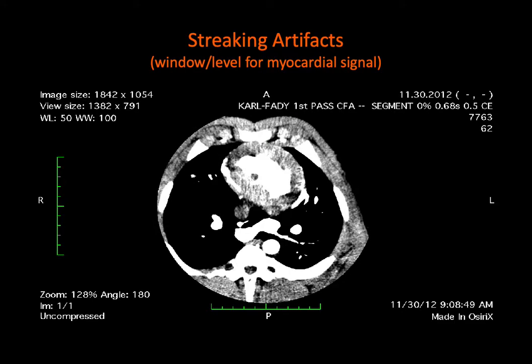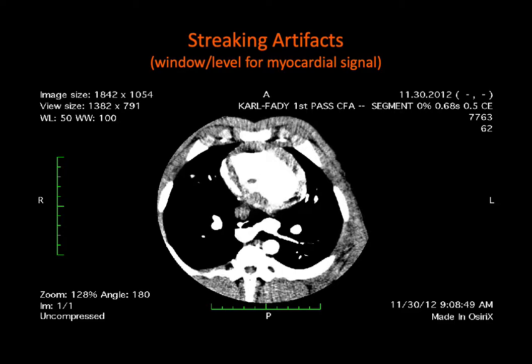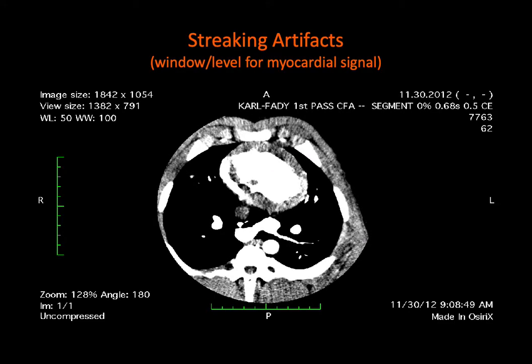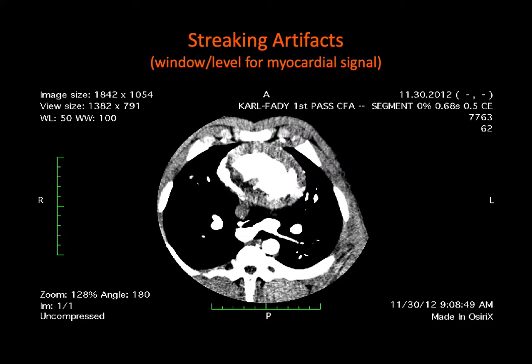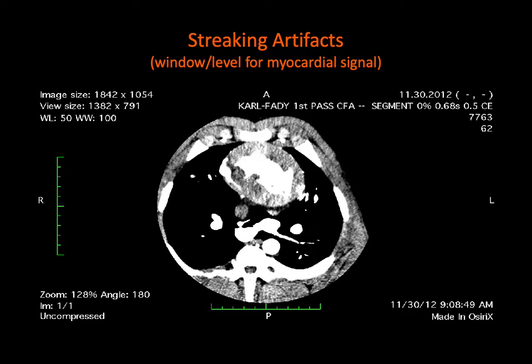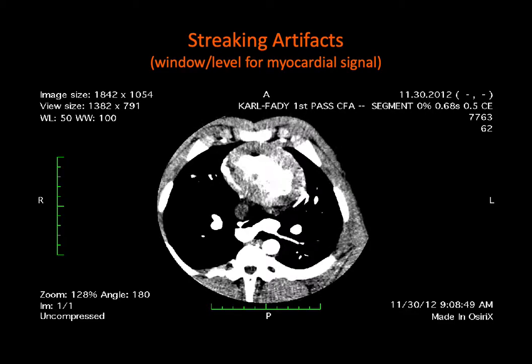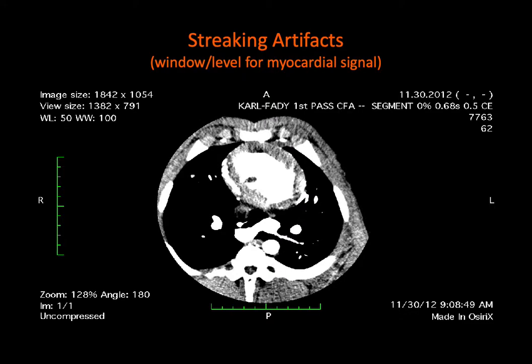See the noise-like spinning around the picture. And that would correspond to what? Spinning and collecting different angles. Right, so there's kind of a model that you can think of, all right, in one of these views the scan was directed in this direction, and now, one frame later it's pointing in this direction, and it seems to spin in a way that makes sense given scan acquisition protocols.